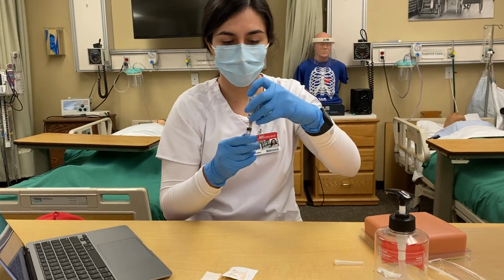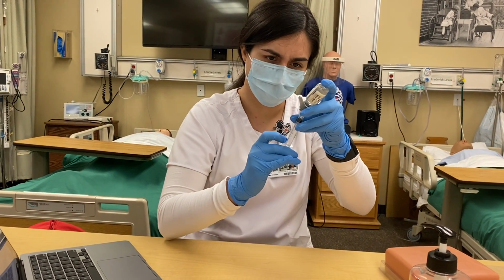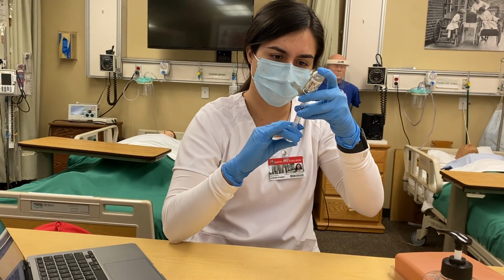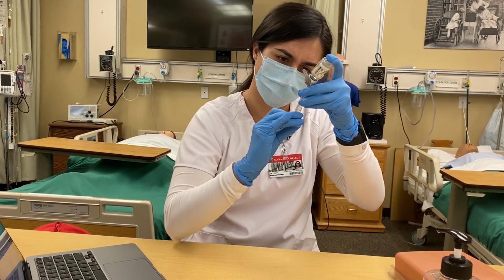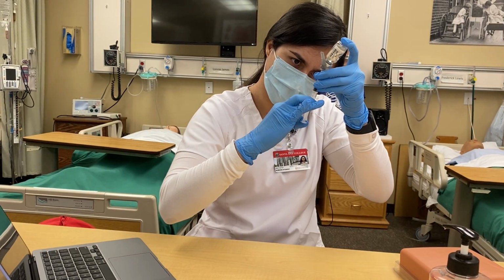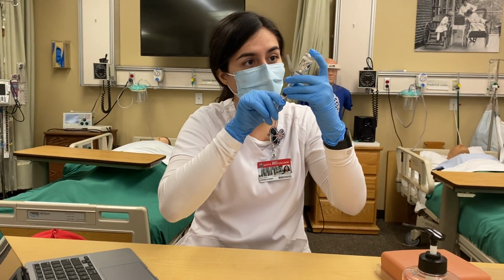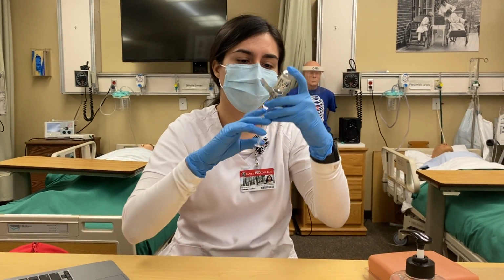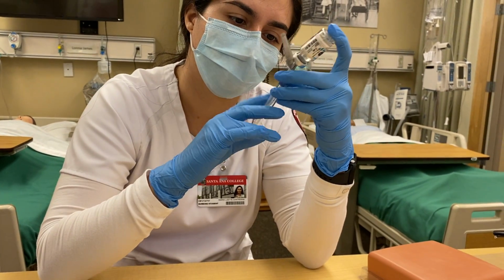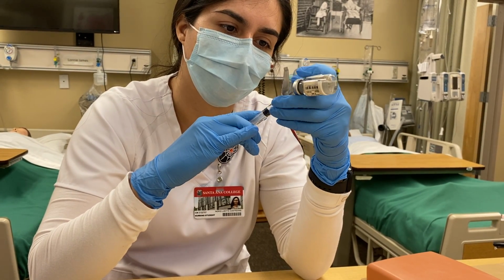Okay. So there's air. I have to put it in, and there's still air. So this is kind of hard.